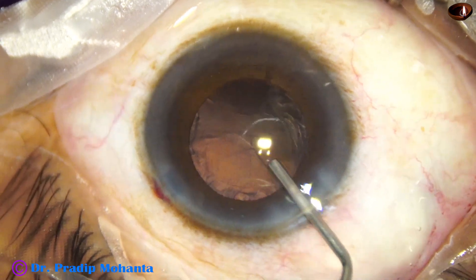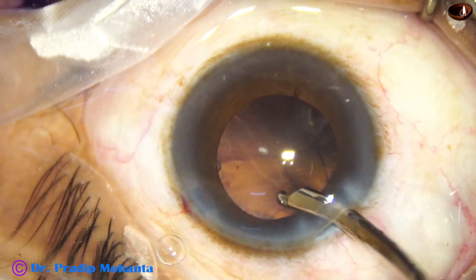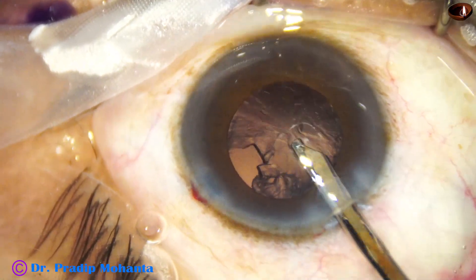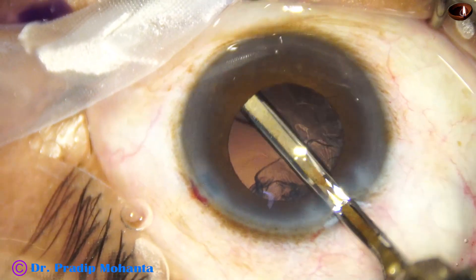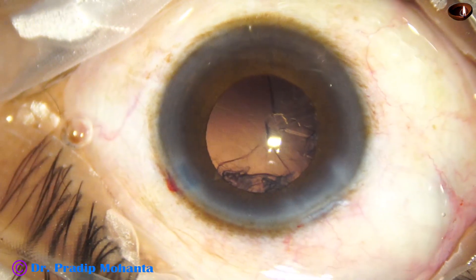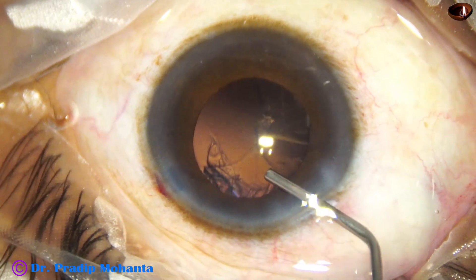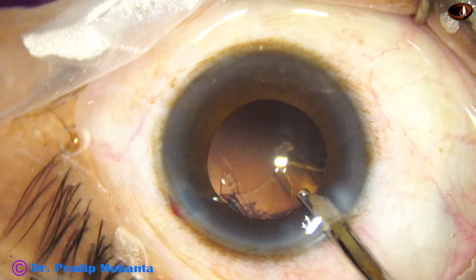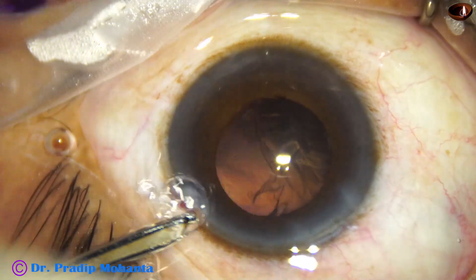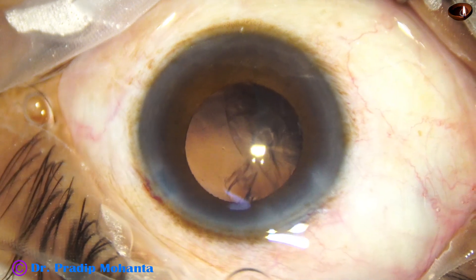Some viscoelastic now to maintain the anterior chamber. And I am going to use a beautiful instrument — a 23-gauge Simcoe cannula to remove the cortex. This is not an instrument patented only for SICS surgeons; we FACO surgeons can also use it. This is a very safe instrument, and control is in our hands — we can apply very gentle vacuum.